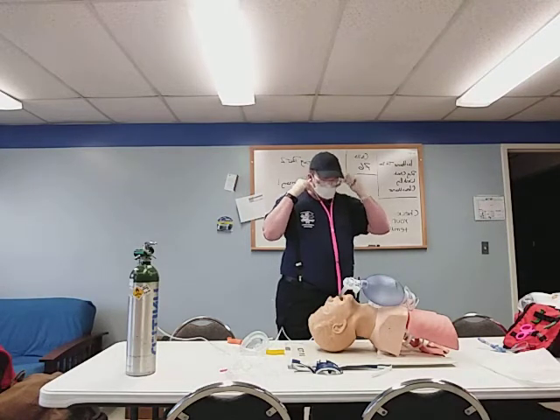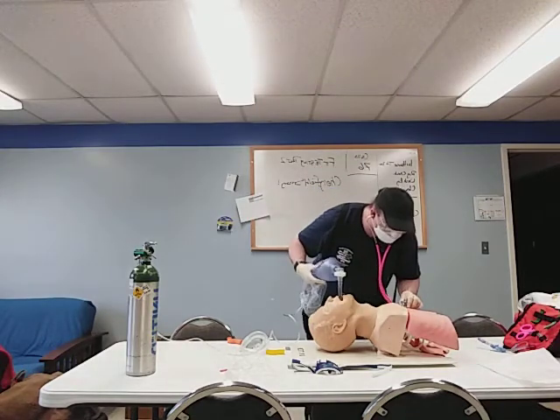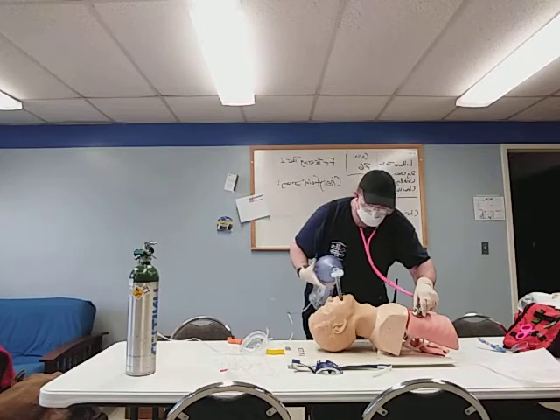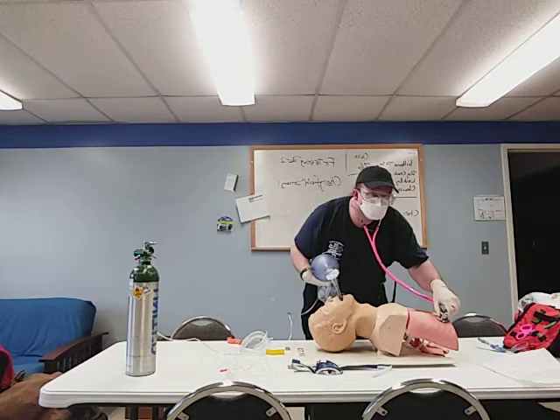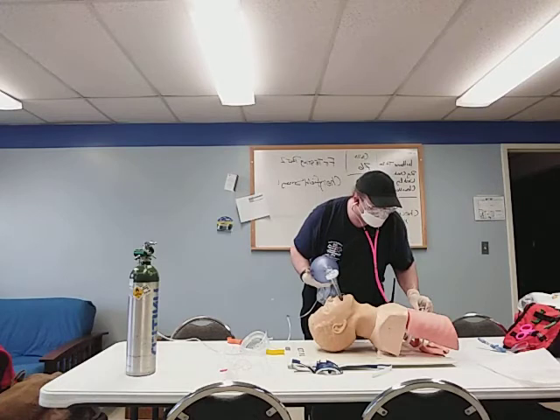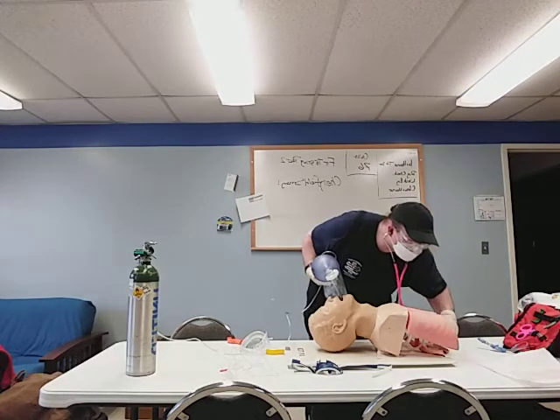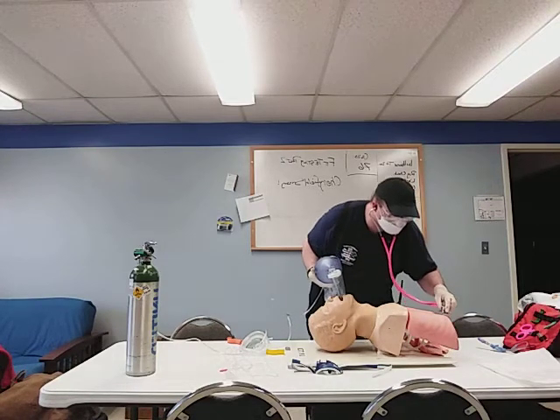Now I'm going to auscultate the 4 quadrants of the lungs, making sure I have equal breath sounds bilaterally. And most importantly, also listen to the epigastrium.